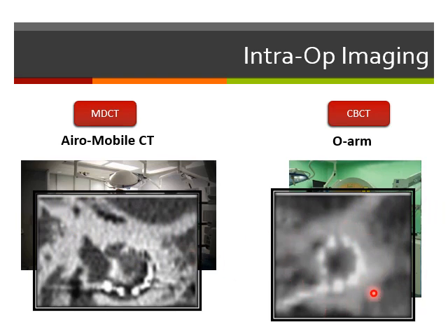As we all know, cone beam CT has the privilege of a lower dose of radiation than the multi-detector CT. Number two, it may give us better spatial resolution regarding the bony structure, and it has less metal artifact. So this is a very excellent option in our cases of CI. As we can see here, I can count the electrodes properly, well in relation to the multi-detector CT.